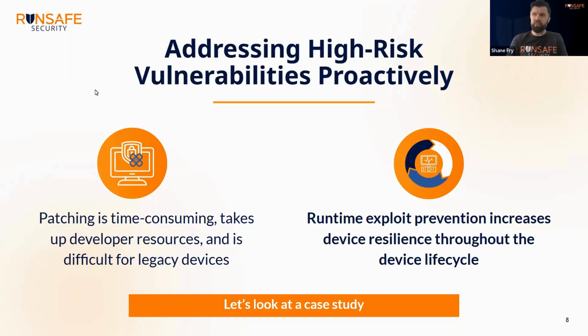One of the things we see a lot in the medical space is, patching takes time for embedded devices, for medical devices where you've got patient safety concerns. You can't just run something through a CI pipeline, ship it, and hope that it's good, right? You've got to have some confidence in what you've shipped. So that means really understanding what you're patching and making sure that the fix works, the vulnerability is gone, but then also that you haven't caused a situation where someone's life is at risk, or invalid results are coming out of a patient monitor or something like that.